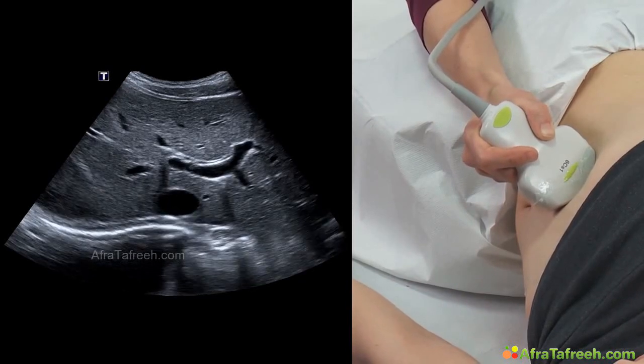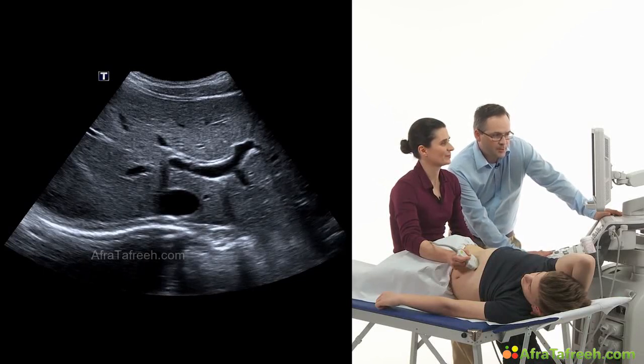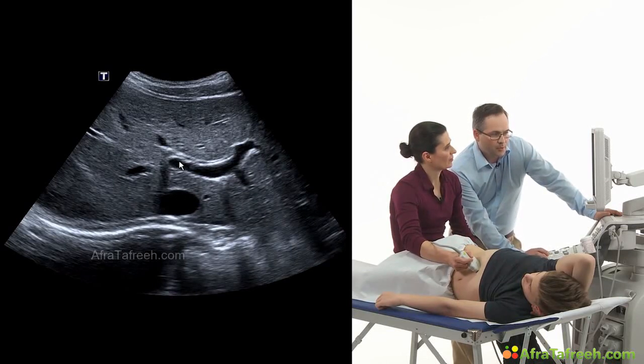So perfect. You scanned the porta hepatis, but you can also say this is a jumping deer, which is jumping over the vena cava inferior over here. So we have the body of the deer, which represents the portal vein and its branches, over here and over here. And you can even see the bile ducts on the back of the deer very nicely. So, great picture. Now let's get on.